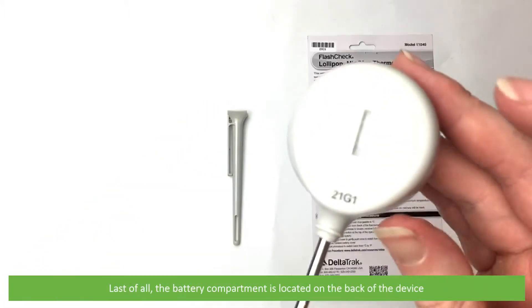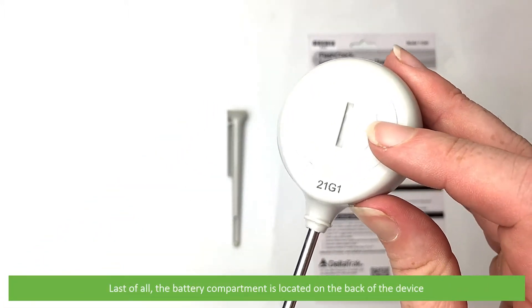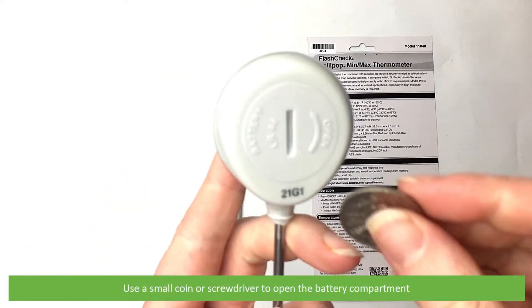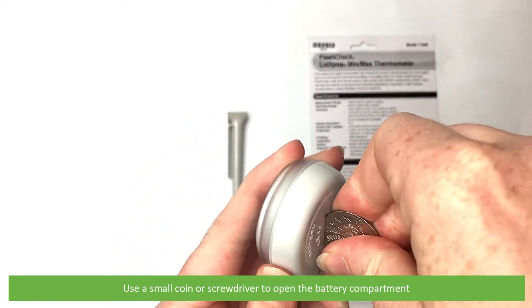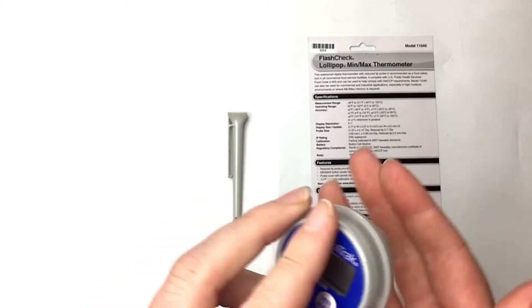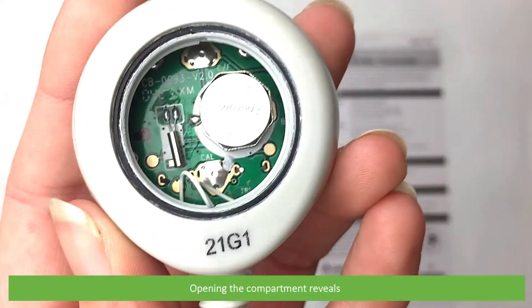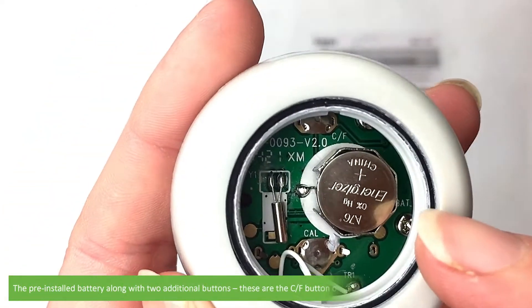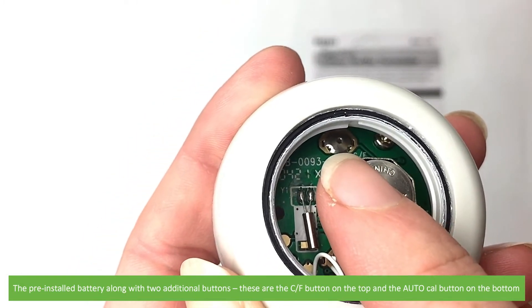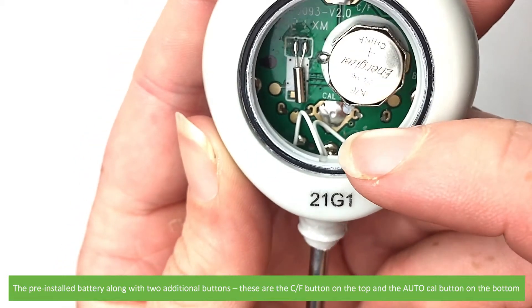The battery compartment is located on the back of the device. Use a small coin or screwdriver to open the battery compartment. Opening the compartment reveals the pre-installed battery along with two additional buttons — the Celsius/Fahrenheit button on the top and the AutoCal button on the bottom.